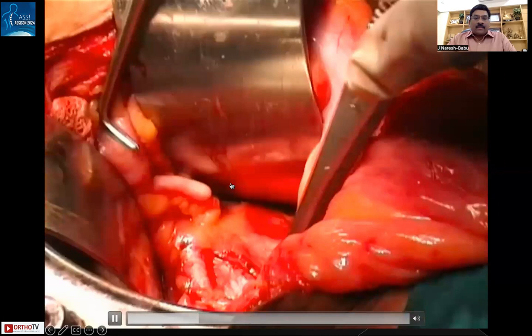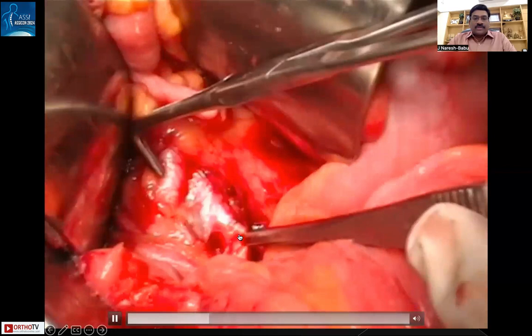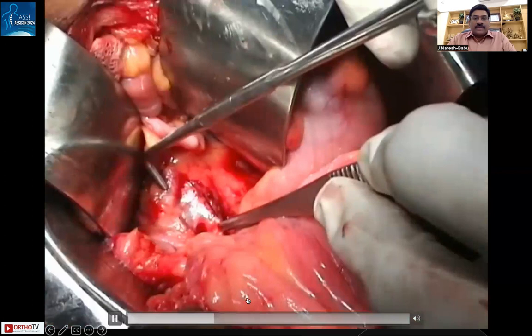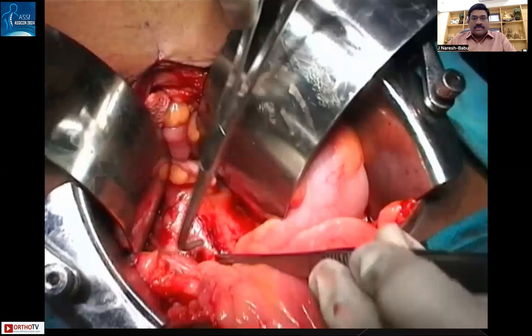The internal iliac vessels are first identified and separated from surrounding tissue. The artery and vein run close to each other. The forceps here are holding the internal iliac artery which is being ligated. We do not need to cut the vessels — we only need to ligate them so that circulation to the tumor is reduced and the posterior surgery becomes relatively bloodless.